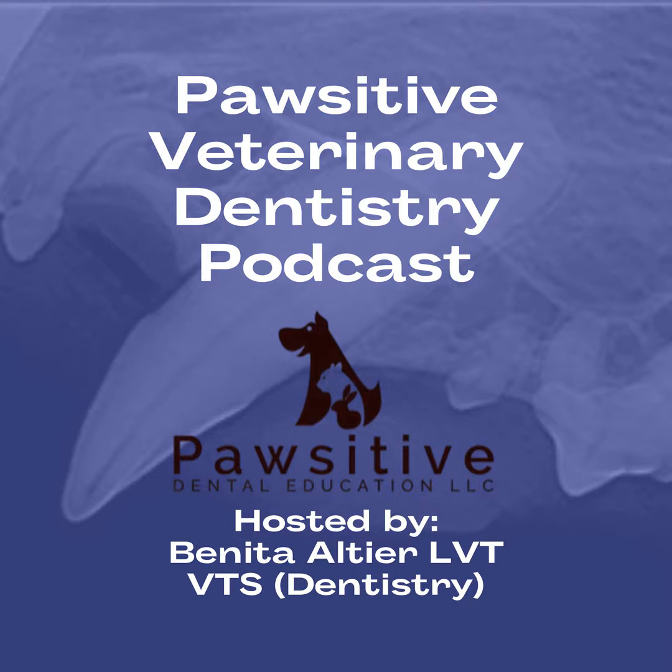So, speaking of normal variations, I love that you mentioned that you look at the other side of the patient's face. I think that's just so critical because, as you mentioned, they are their own control set, where if we don't see something similar on the other side, then we'd be more concerned. Because I have found through taking dental x-rays full mouth on thousands of patients over the last 24 years that they often are very symmetrical in what's normal for them. So I think that's always just a really good piece of advice.